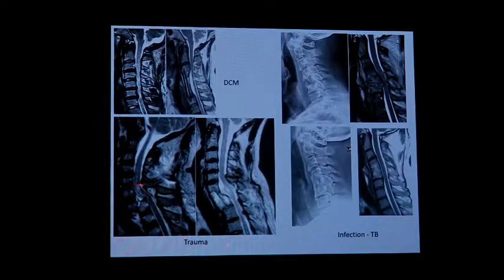But this is the patient with spondyloptosis who came to us, I think, a year or more after the injury, and we did this corpectomy. It was difficult because you have to remove this bone and that bone behind, and you have to make a mortise quite deep down. This is 2, 3, 4, 5, 6, 7, 1, 2. So you have to reach T2. But we didn't do a sternotomy or any such thing, manubrium. We just went in through the neck, a low incision. But we did put this patient into a halo. So we put the patient into a halo, and a year later, this is the kind of result we obtained.